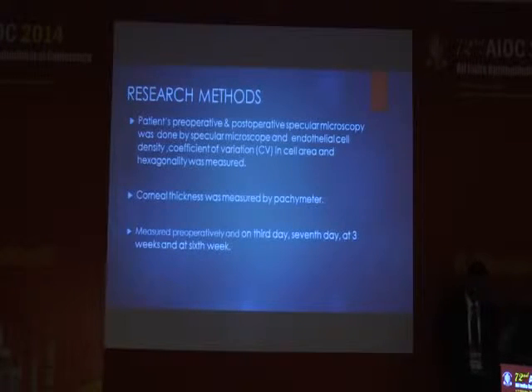Patient's preoperative and postoperative specular microscopy was done by specular microscope, and endothelial cell density, coefficient of variation in cell area and hexagonality were measured. Corneal thickness was measured by a pachymeter.